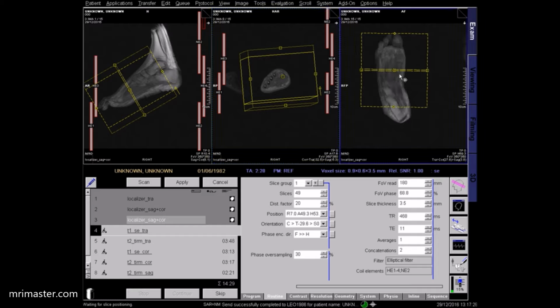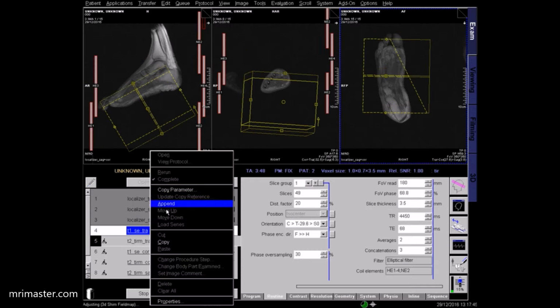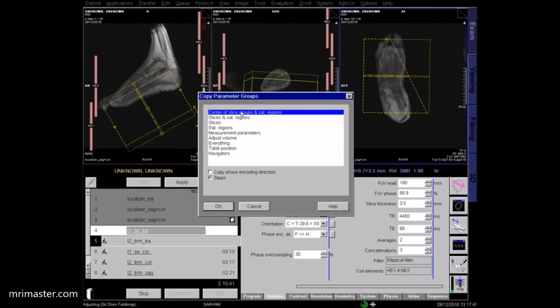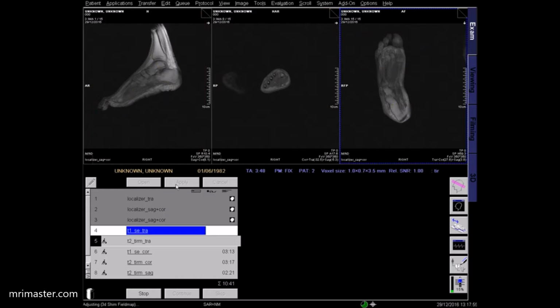Position the slices perpendicular to the long axis of the metatarsals on the coronal view and apply. For the subsequent STIR axial, you can copy the planning of the first T1 axial sequence. Check the planning in all three planes and apply.